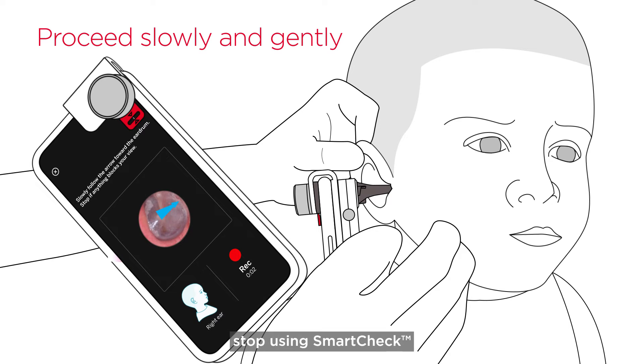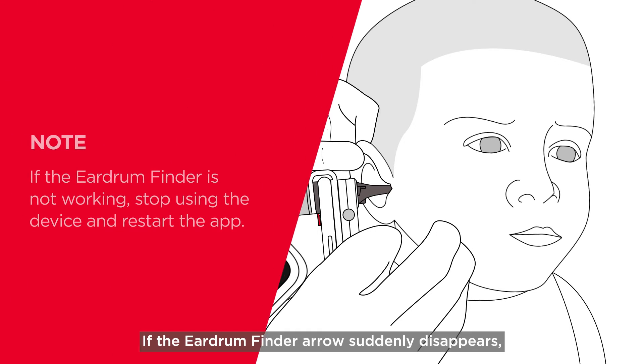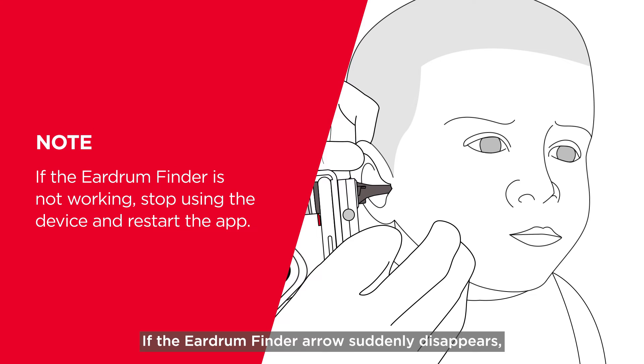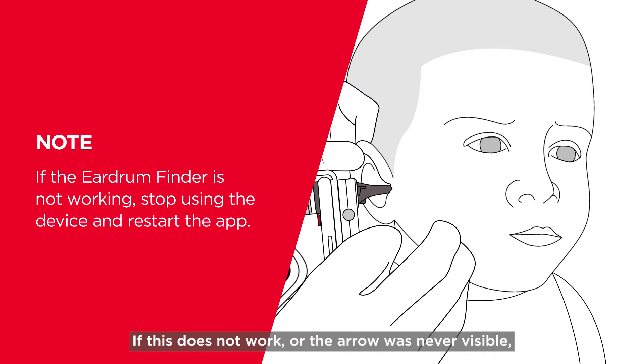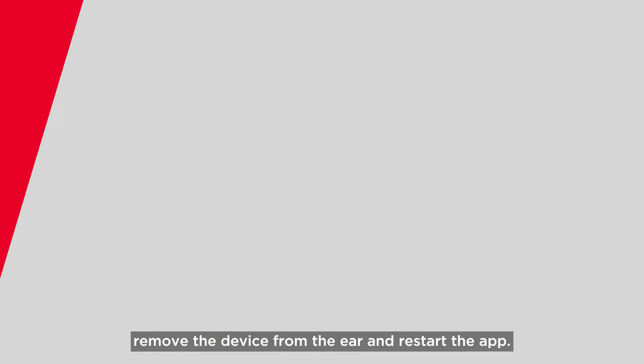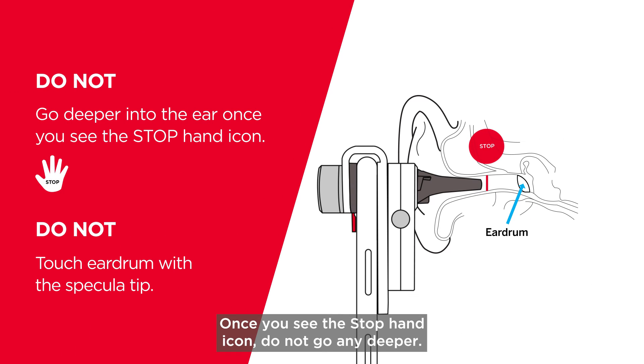If you see any blockages, stop using SmartCheck and contact your healthcare provider. If the eardrum finder arrow suddenly disappears, try gently pointing the specula tip in slightly different directions until it reappears. If this does not work or the arrow was never visible, remove the device from the ear and restart the app.